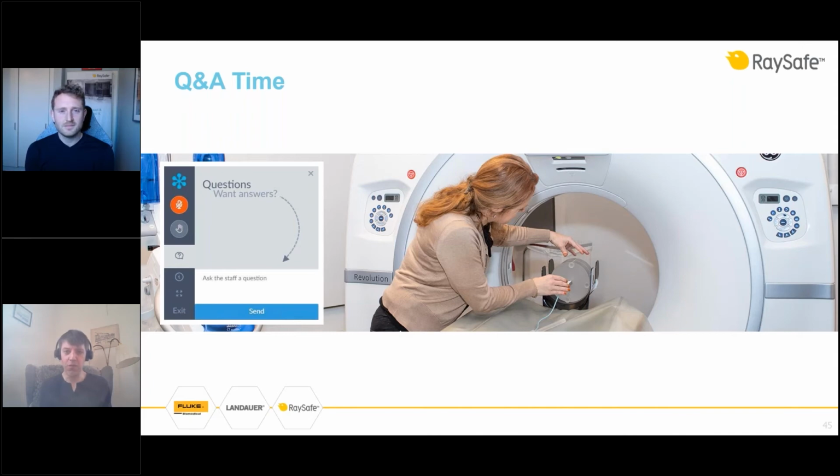If you do want to know what the temperature and pressure was, there is a way to do that. It's a little bit hidden because we didn't want it to be too obvious, just so that people don't by mistake apply a manual correction.